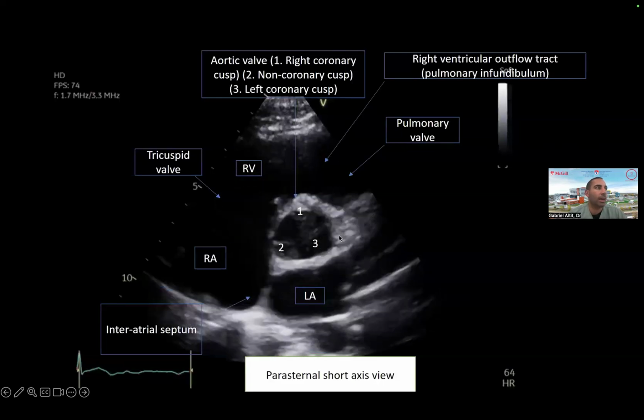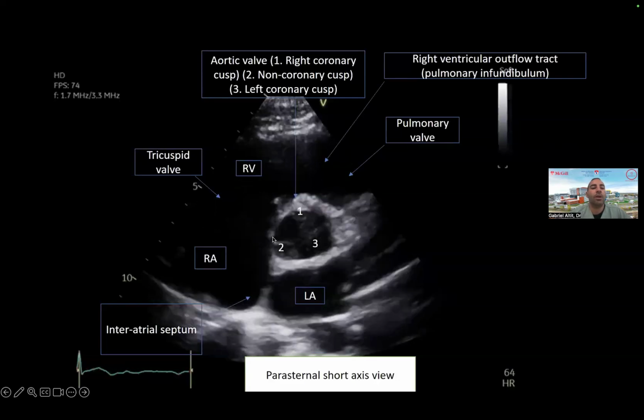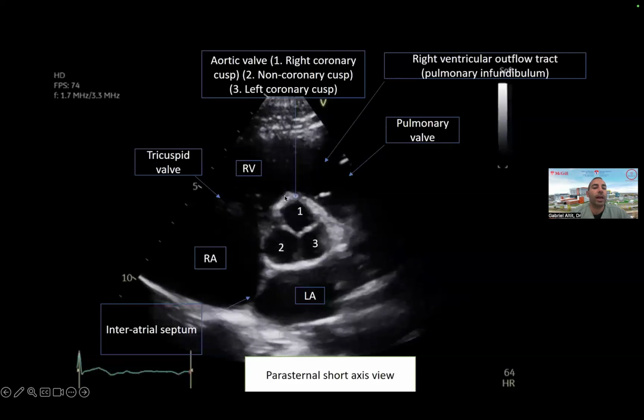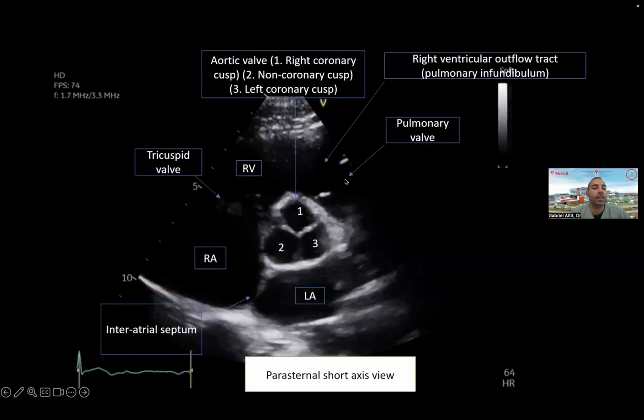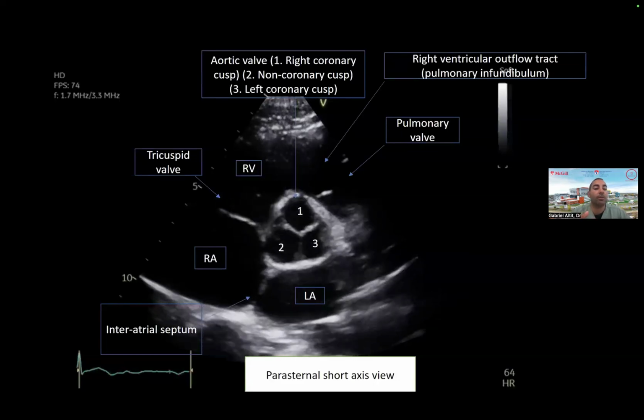Majority of patients, right? You have coronary patients with coronary abnormalities. And then you have the non-coronary cusp because usually you don't have a coronary here. You can appreciate how I see my aortic valve from in front, versus my pulmonary valve, I see it from the sideline. So you can appreciate that these vessels are not parallel. Actually, the aorta is coming out of the screen.